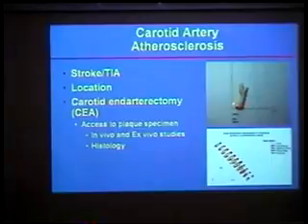And once you have the specimen, you can do all the histology you want. That is critical for imagers like us, because in order to make any statement about what we truly see in the human artery, we have to have references. In this case, we can use the specimen as the reference to say that what we see in vivo is truly what we see in the histologic studies of the specimen. This is why we chose to study the carotid: if you look at all the vasculature in the body, this is truly the only artery you can get from living patients. From other places, you cannot get very nice specimens like this.